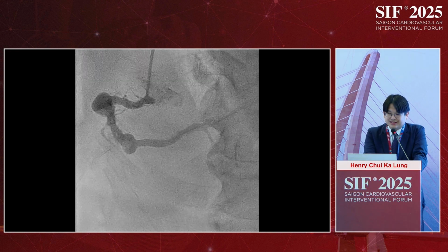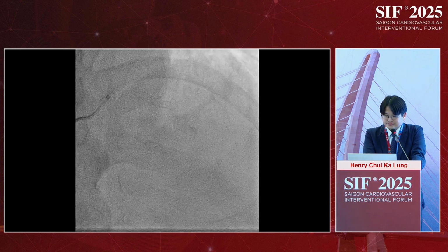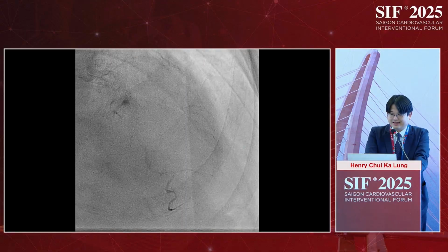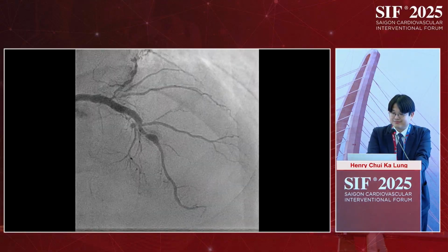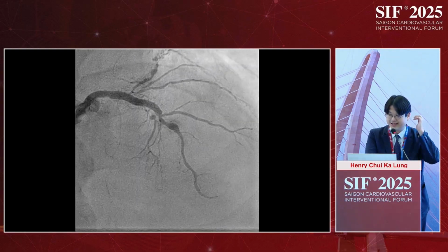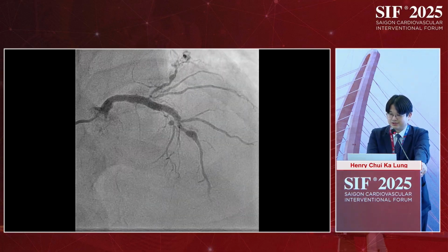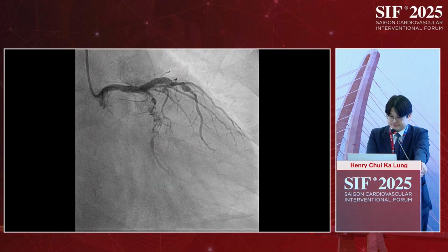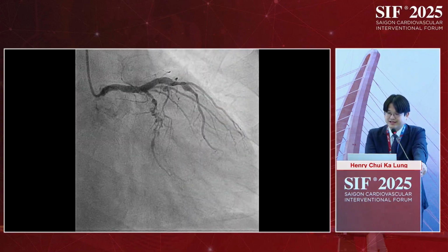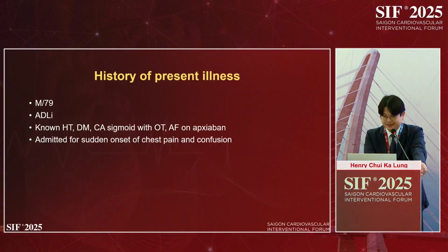So we actually managed to do a follow-up angiogram 2 years later, and there is still the aneurysm in the RCA, and you still have the aneurysmal changes in the LAD, but in the delayed imaging, you can see some myocardial bridging in the mid-LAD because the adventitial layers are heavily infiltrated by some of the tissues. Circumflex CTO, but small, we don't want to do because it's a small territory and probably not beneficial to do this complex small-territory CTO in the circumflex.